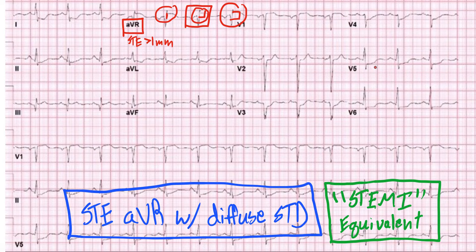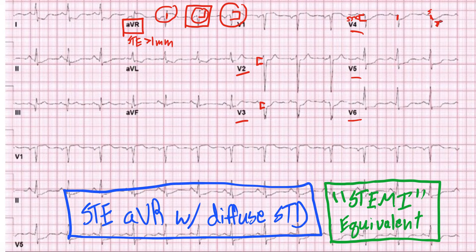Then if you look diffusely throughout the other leads, here we have our precordial leads: V2, V3, V4, V5, V6. And you get these ST depressions. So ST depressions there, there, there — this is a really blatant one. ST depression — we're specifically looking at that segment right there. Here's going to be your T wave, S wave, and you get this ST depression. You can see this throughout: ST depression here, ST depression here.